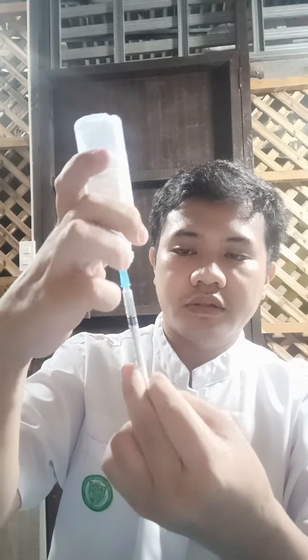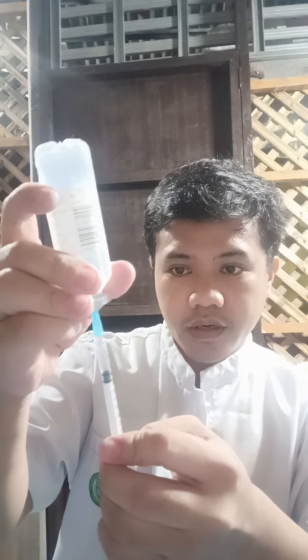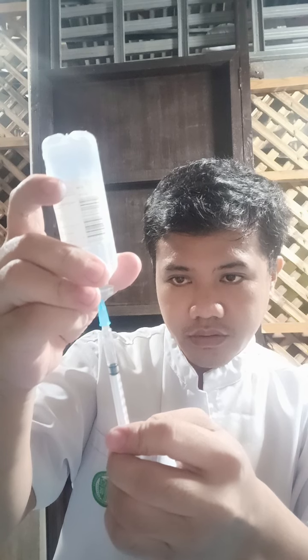Then remove the cap of the aspirating needle on the syringe. Insert it in the medication vial. Then inject the air that we drew. And now we will draw the recommended units that we need for our subcutaneous injection.